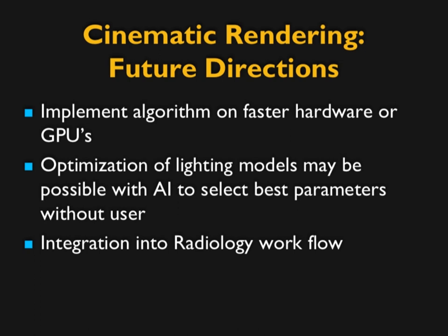If it's very complicated to use AI, and if AI can only with complex nature give me very good images, I'm probably not going to use it. But since many people don't do 3D imaging, can't figure out what the presets are, can't figure out how to do things, AI could potentially solve that problem and introduce 3D into the workplace and workflow. So that's an interesting thought, but we'll have to see what happens.